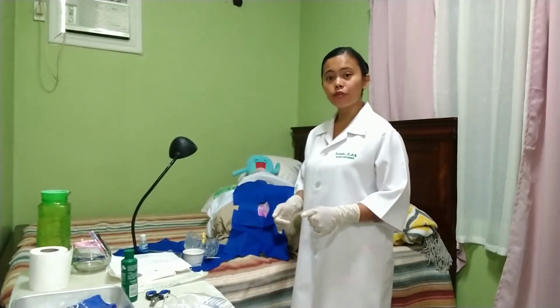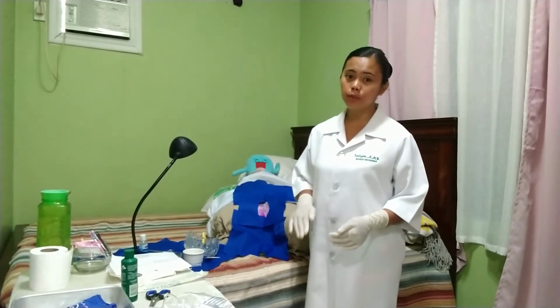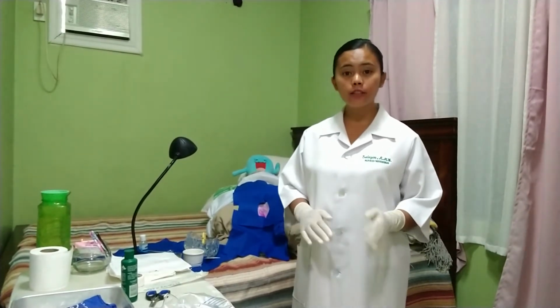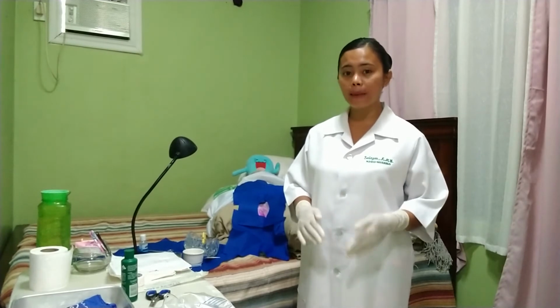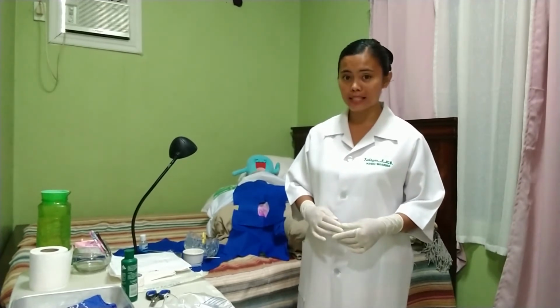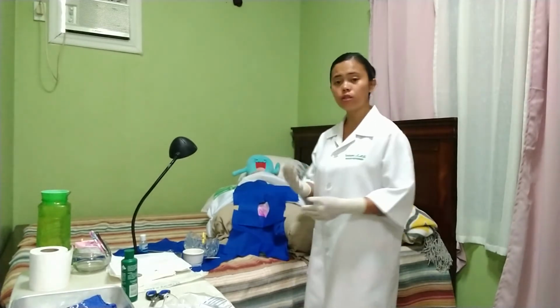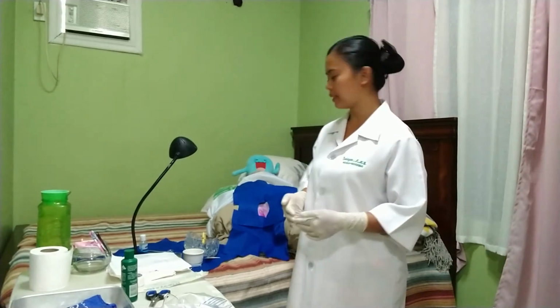The next procedure is to lubricate the tip of our catheter. For female, we have to lubricate it between 1 to 2 inches, while for male, we have to lubricate it from 6 to 7 inches generously. This is to prevent mechanical injury to our patient and to avoid damaging the mucosa of our client.